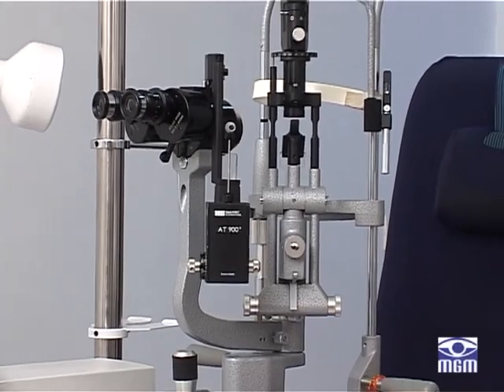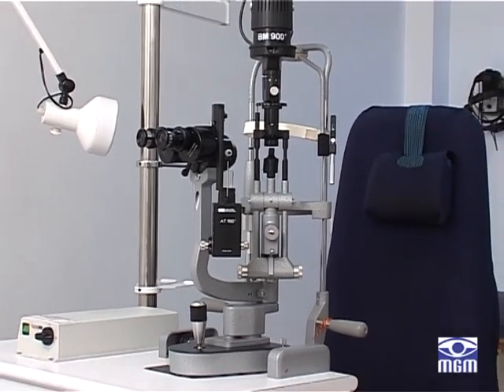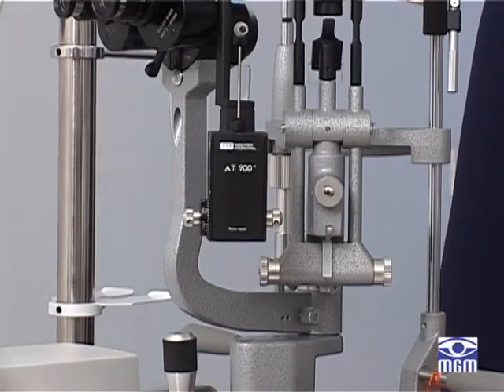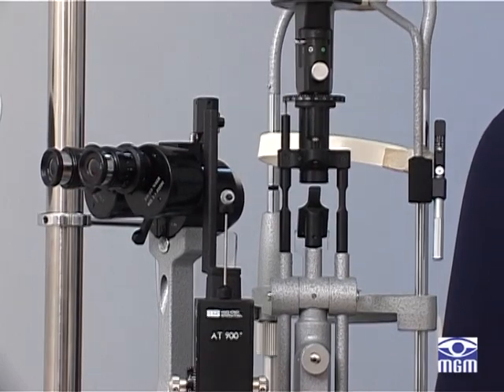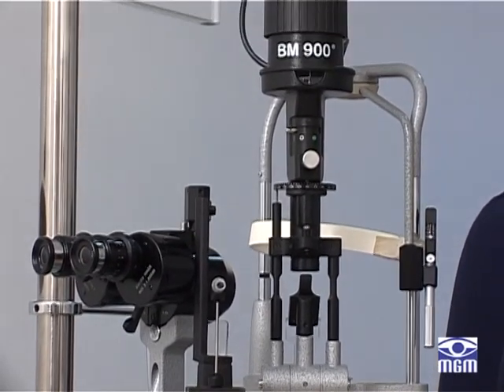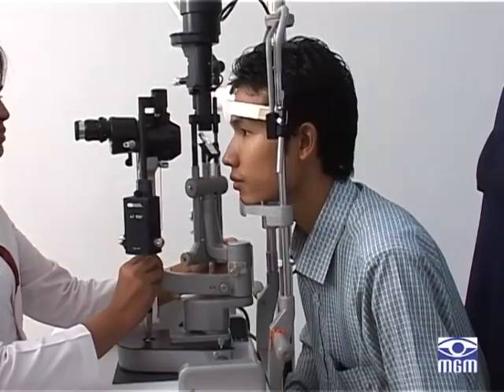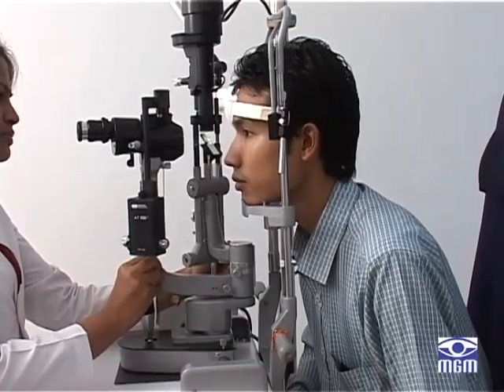Slit lamp biomicroscopy is a dynamic examination in which the eye is scanned anteroposteriorly and horizontally. Various ocular conditions can be identified by different methods of examination. These differ in the positioning of the illuminating light and the angle between the illumination and observation arms.